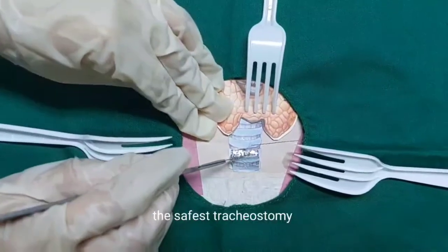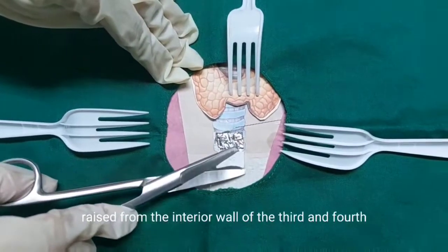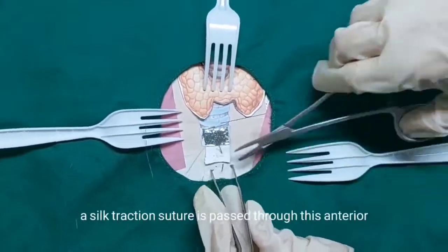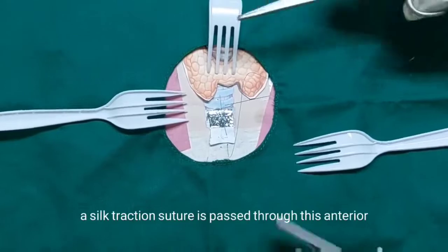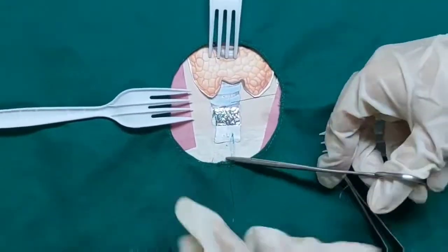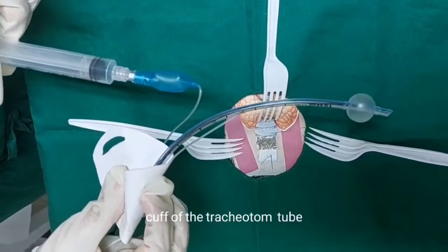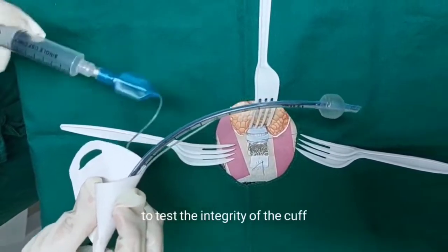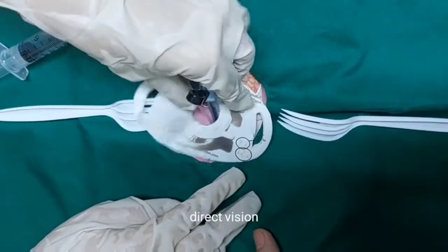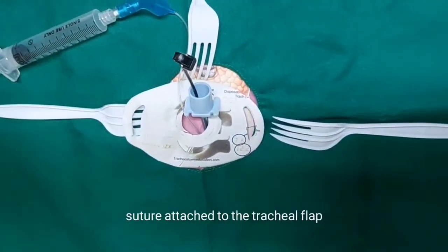The safest tracheostomy in adults is to create an inferiorly based flap raised from the anterior wall of the third and fourth tracheal rings. A silk traction suture is passed through this anterior tracheal flap and loosely secured to the skin. Inject air into the inflatable cuff of the tracheostomy tube to test the integrity of the cuff. Insert the tracheostomy tube under direct vision while applying traction to the silk traction suture attached to the tracheal flap.